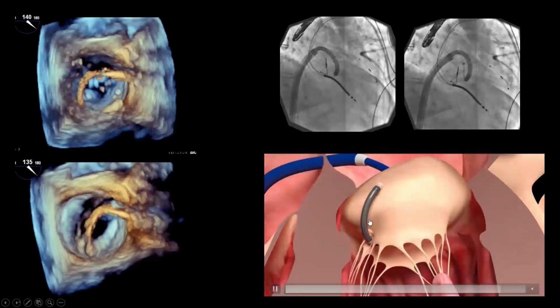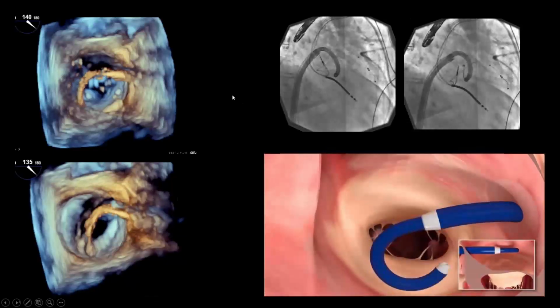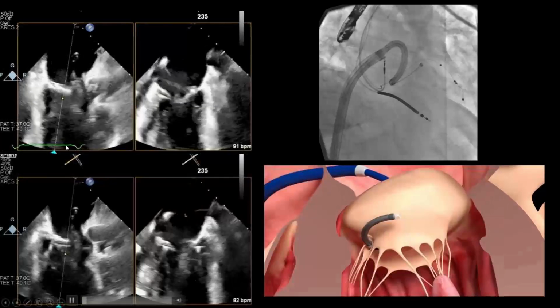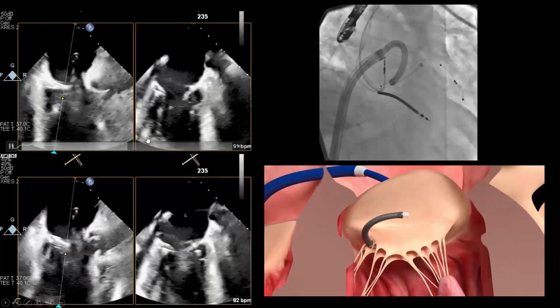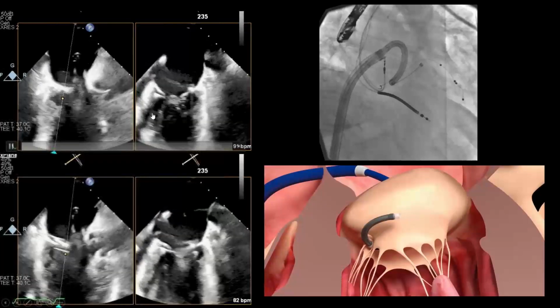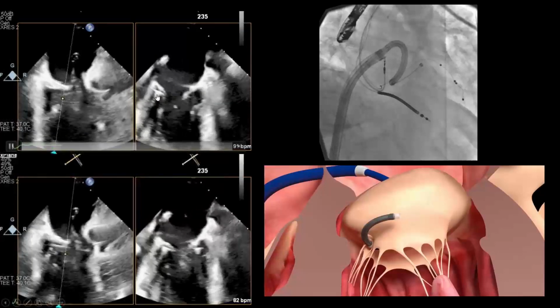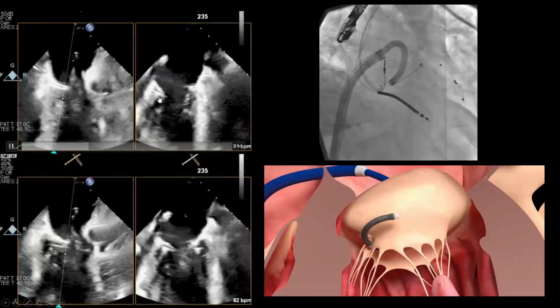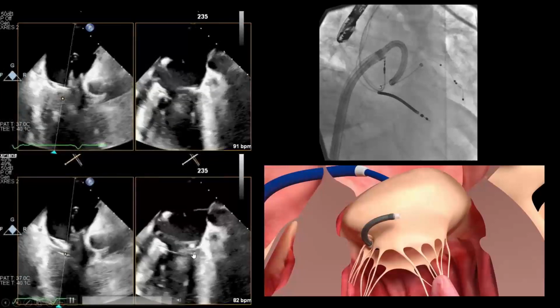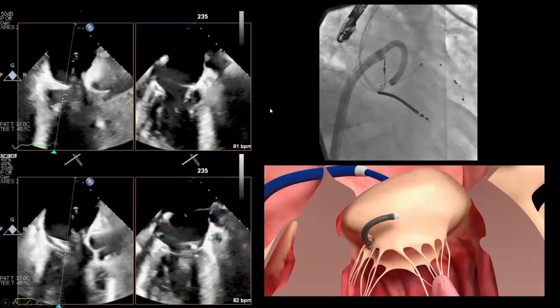And you can see here, once the device is under the mitral valve, we would advance the leading turn. So we'll go to the next slide. And you can see here, okay, so these videos are working. In this procedure, we explain from the long axis, and over here you see a bicommissural view. Over here, you would have a medial side of the mitral valve, and this is the lateral side, and you can see that there is this white bright dot under the medial commissure. And then in the lower picture, you see 2 dots under the medial commissure and 1 dot under the lateral commissure, indicating that the first turn or the leading turn of the docking system is complete.